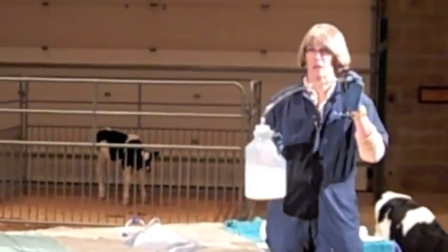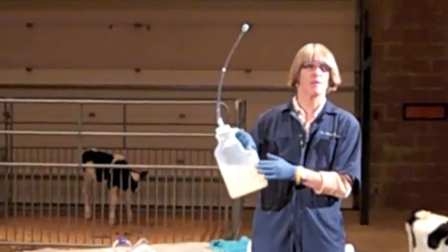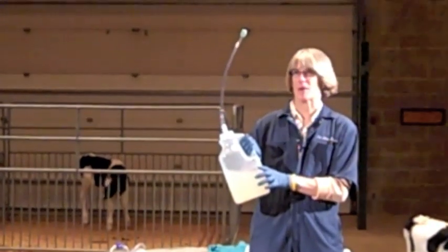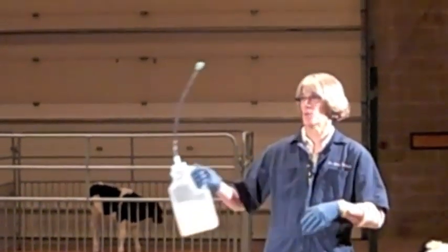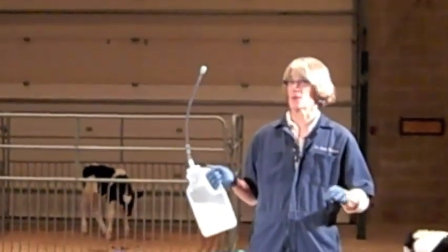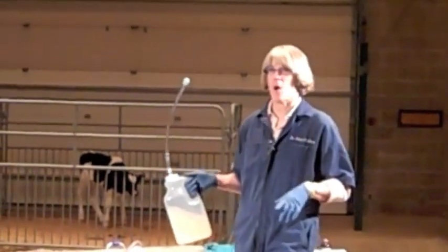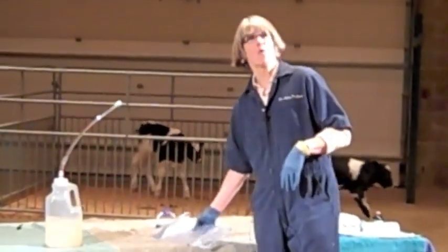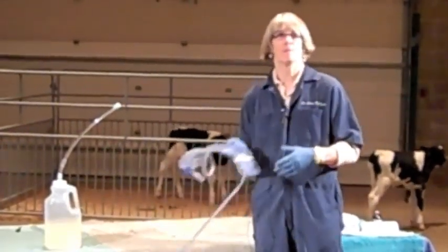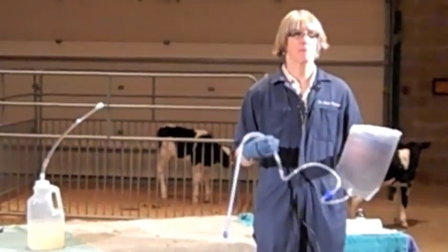If you have one-gallon esophageal feeders, they should be in the colostrum area. The one-gallon feeders don't go for sick calves — put them where all the colostrum administration materials are, with your replacement products and things like that. In the case of calves with diarrhea, the two-quart feeders are great because we generally administer two quarts of electrolytes at a time.